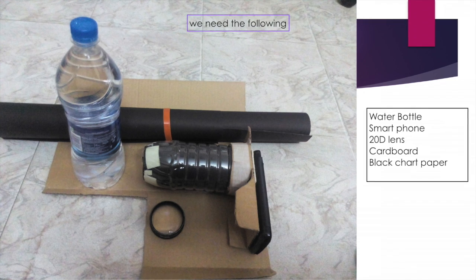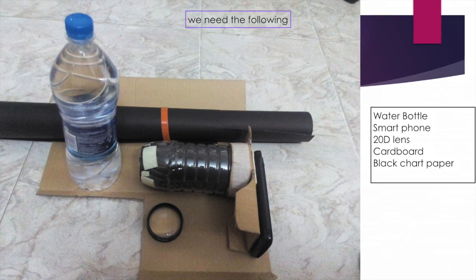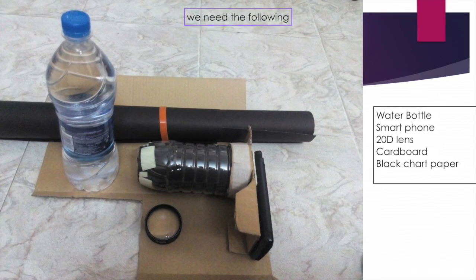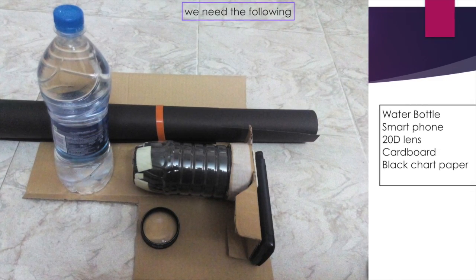All you need is a water bottle, your smartphone, a 20D lens, some cardboard, a black chart paper — and that's how the assembly unit looks.